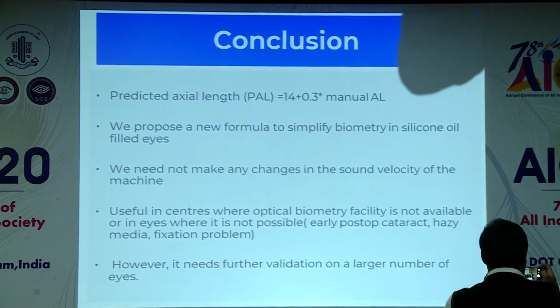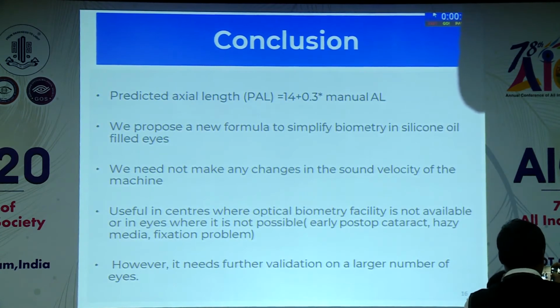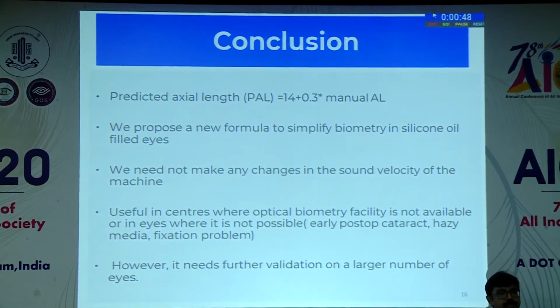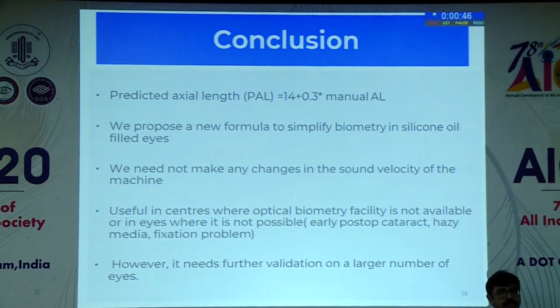To conclude, we propose a new formula to simplify biometry in silicone oil-filled eyes. We do not need to make any changes in the sound velocity of the machine. It is useful in centers where optical biometry facility is not available or in eyes where it is not possible: early post-op cataract, hazy media, fixation problem, etc. However, it needs further validation on a larger group of eyes. Thank you.